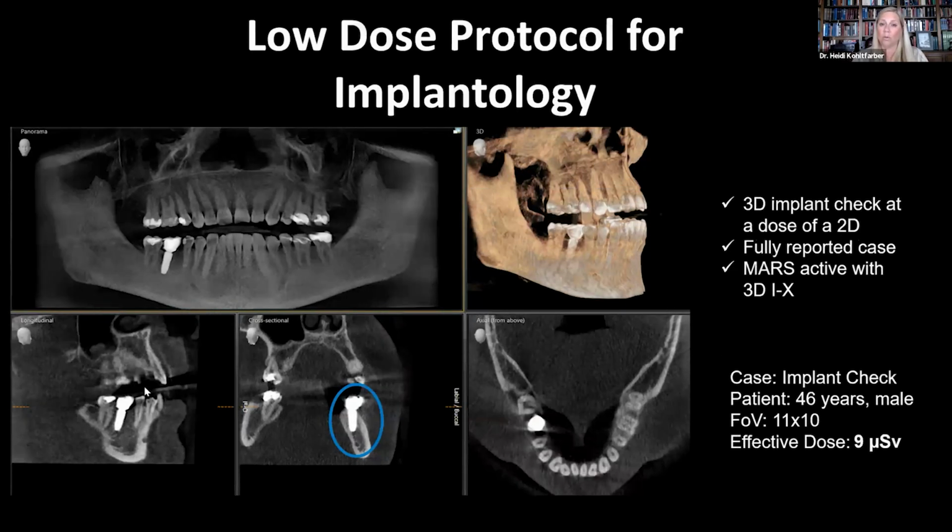But even so, we are still very careful because we tend as a group to take a lot of images. And so the dose of the population as a whole does tend to be more in dentistry because we are taking so many images collectively. So a lot of the CBCT units will have a low dose protocol, which is really amazing.